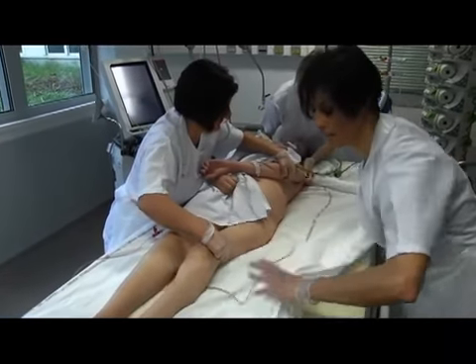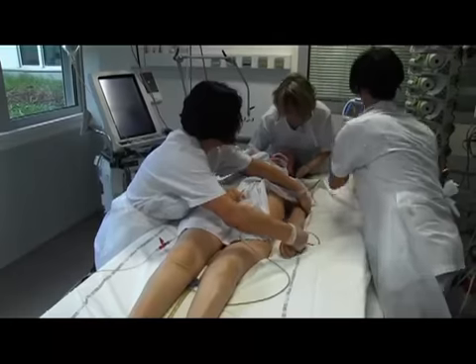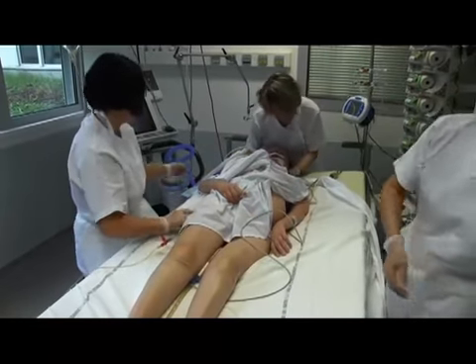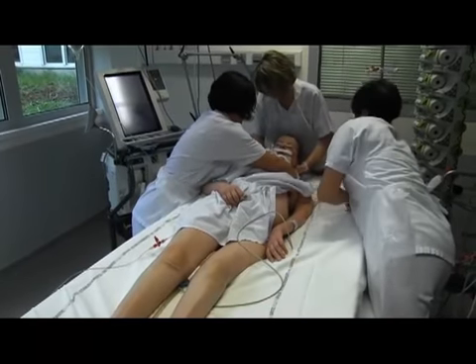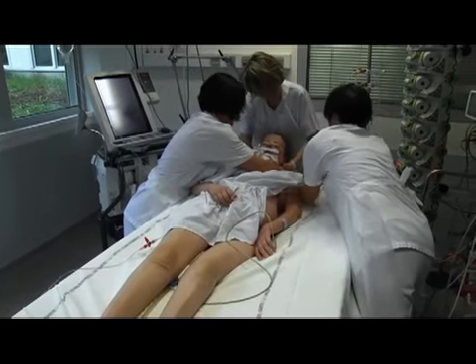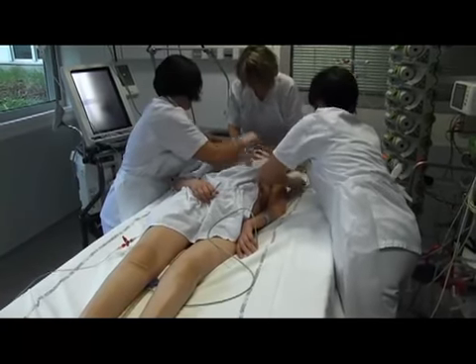To summarize the key points of the procedure: trained and experienced staff, 3-4 people, good preparation of the procedure, horizontal move, side-lying position, complete proning, and post-proning installation.